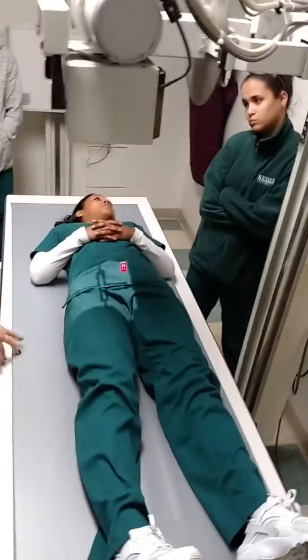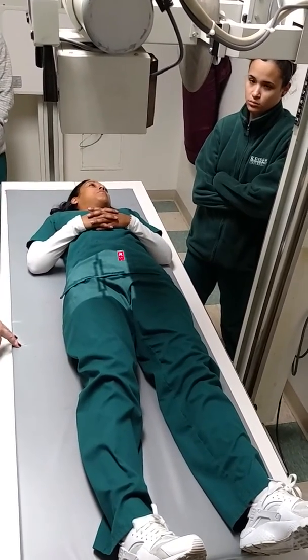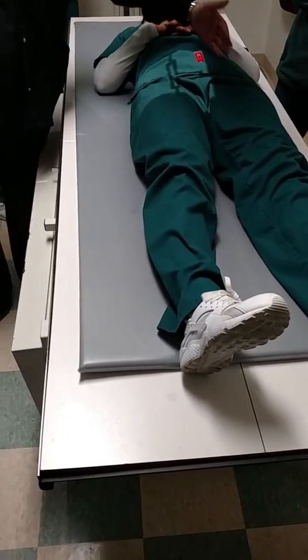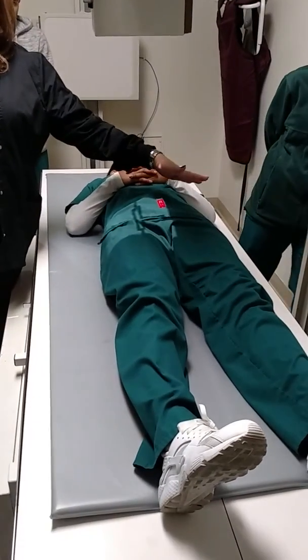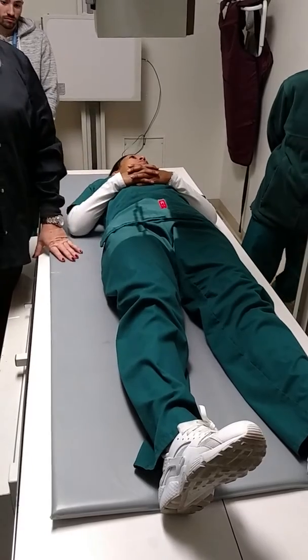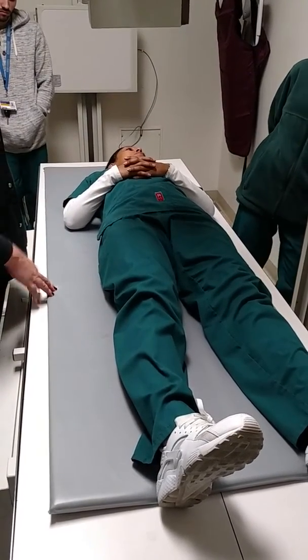I was asking the last group because this looks weird to some people. Is that the correct marker? Yes, because you're on that right. A lot of people go, well, wait a minute, the light's passing into her left, so aren't you telling the doctor that that's her right over there? No, this is a right hip, so it has to be a right marker anywhere on there. So this is an AP hip, hold your breath, beep.